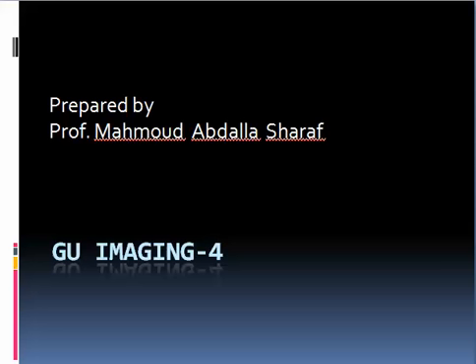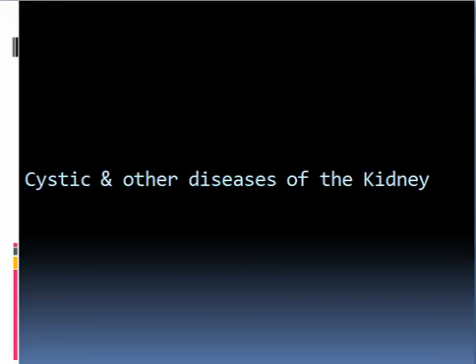Presentation number 4 in the genitourinary imaging series, prepared by Prof. Sharaf. It will be on cystic and other diseases of the kidneys and ureters.